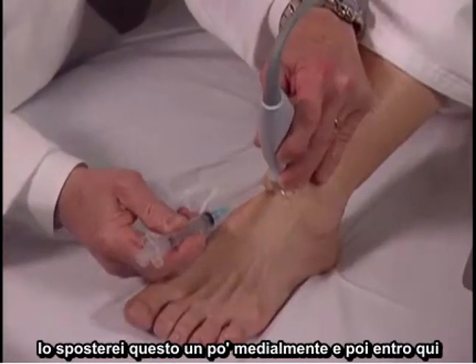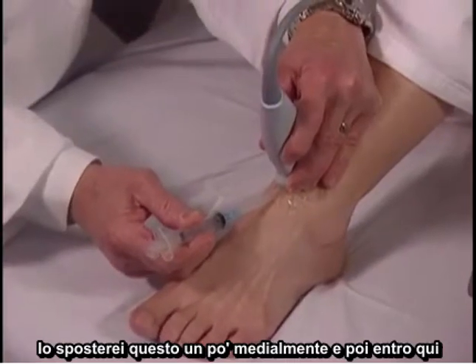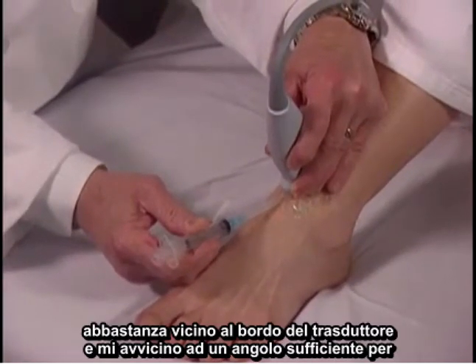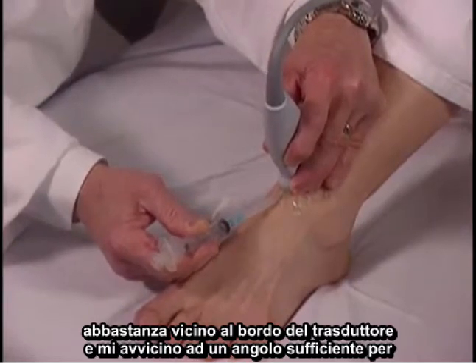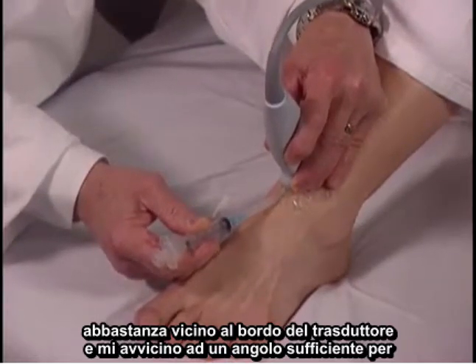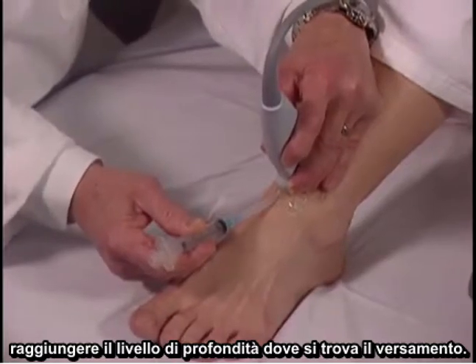So I would move this over a little medially and then enter here relatively close to the transducer edge, going in at an angle sufficient to get down to the depths where the effusion is.